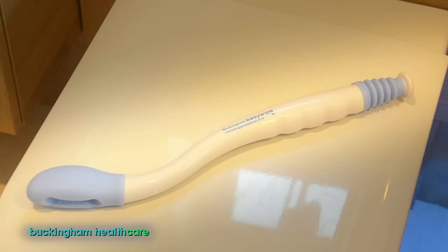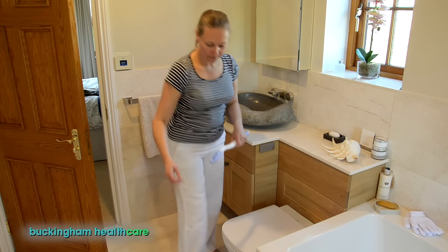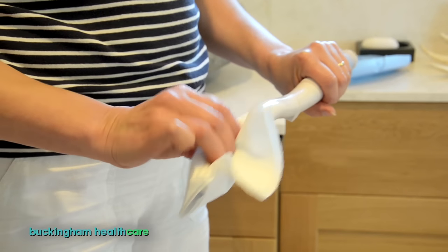This is the Buckingham Easy Wipe and here's how to use it. Take hold of your toilet tissue — four sheets should be enough — and wrap the tissue around the Easy Wipe, tucking both ends into the unique gripping slot.